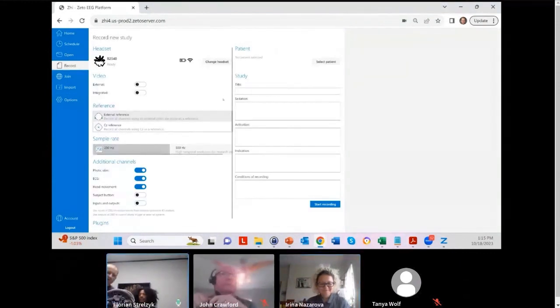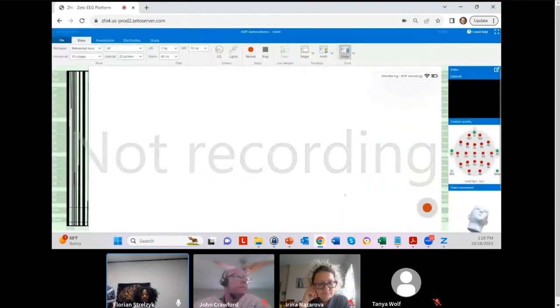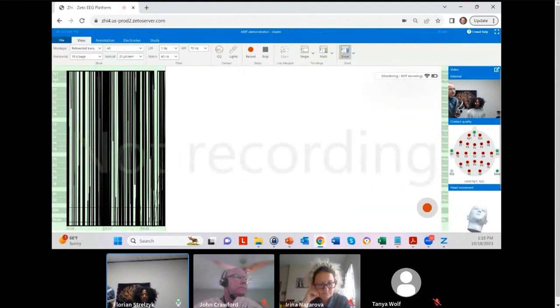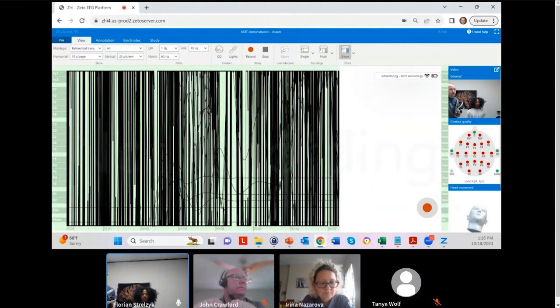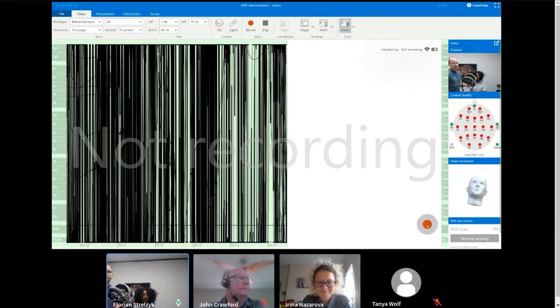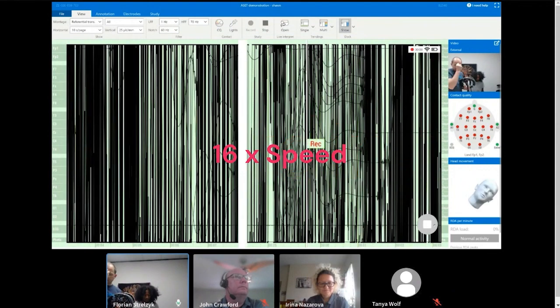So what I've already done, I've already placed individual electrodes. Now, all of you should see a little video on the top right, which is a separate video from the webinar video. You will also see, as I'm moving the headset, you can see a little headset dummy that moves left and right. I'm going to switch to full screen mode. So I'm going to hit the record button, so we have a little bit of a count of how long it will take us to get this done.